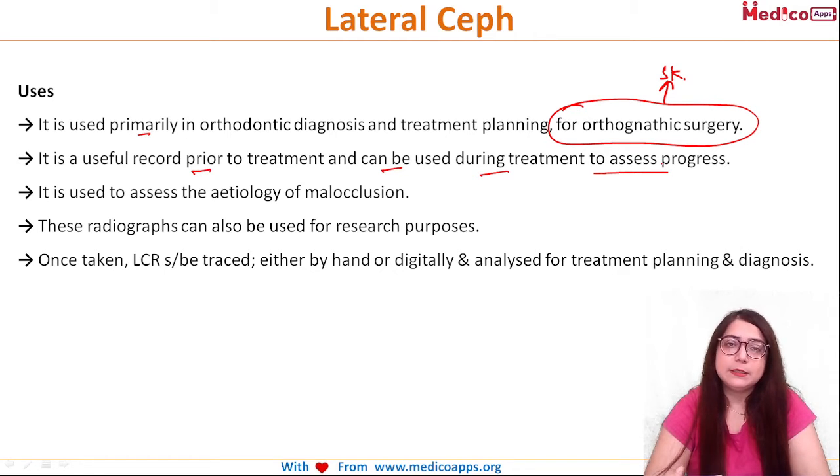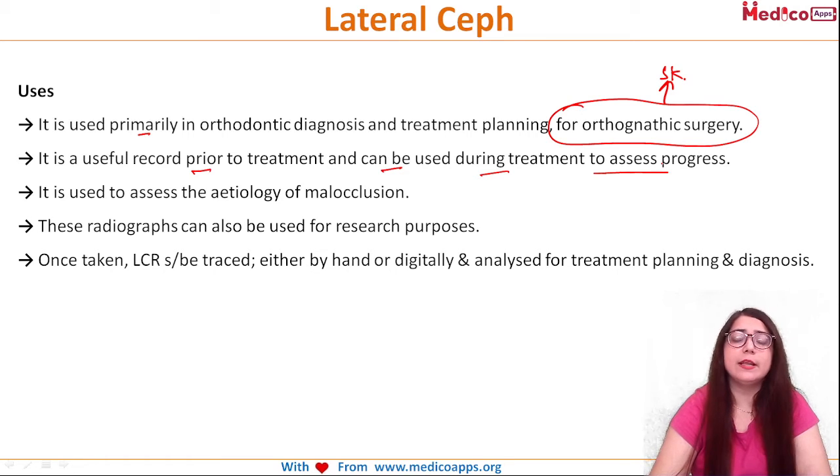Multiple times your doctor may ask you to go for the OPG and the lateral ceph, and the basic thing behind that is they want to check how much they have attained. Initially they'll advise the patient to have a lateral ceph and OPG, and once they are done with the treatment, they'll take them again to compare what difference came, or whether they have accomplished the required amount of what they were planning.